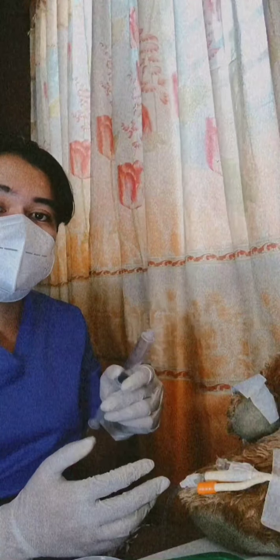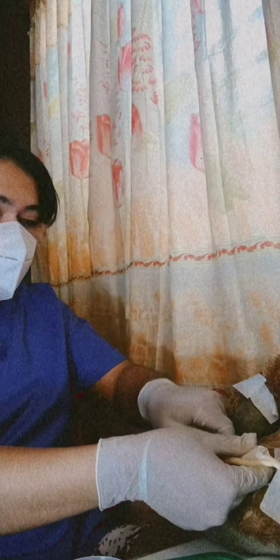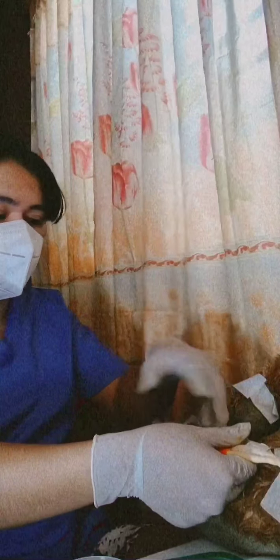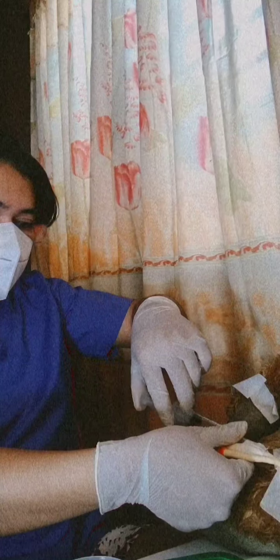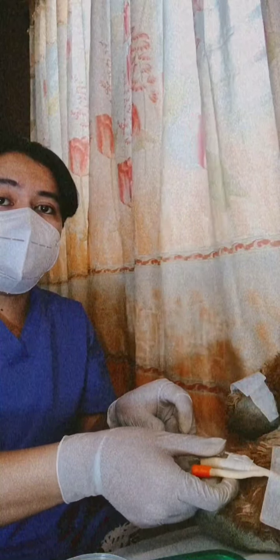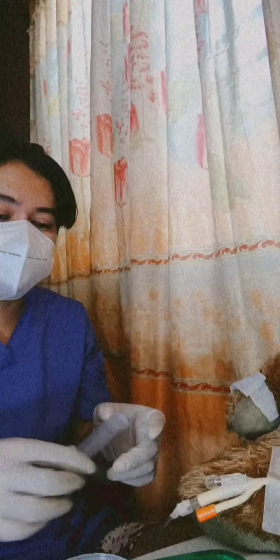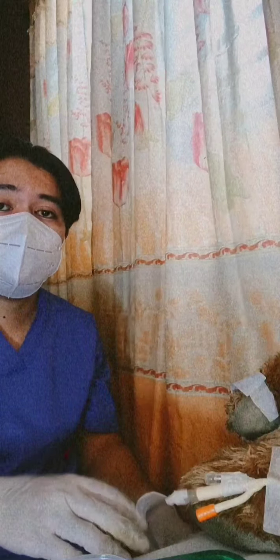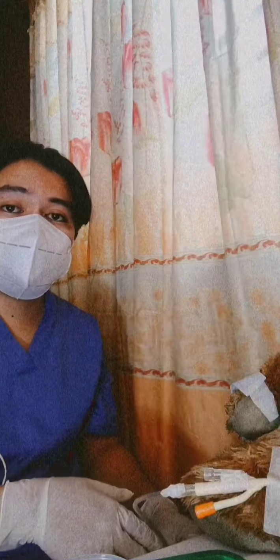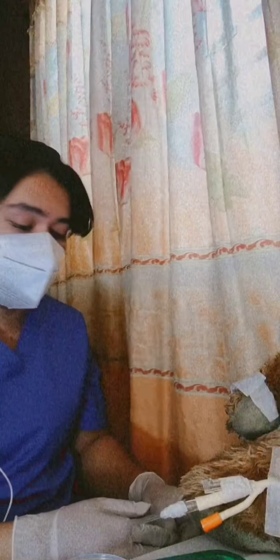Next, we need to attach the syringe to the access port using a twisting motion, and then gently instill the solution into the catheter. Next, remove the syringe from the access port, and then open or remove the fold of the tubing, and let the solution or fluids flow from the tubing to the drainage bag.